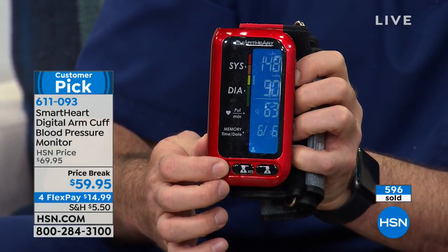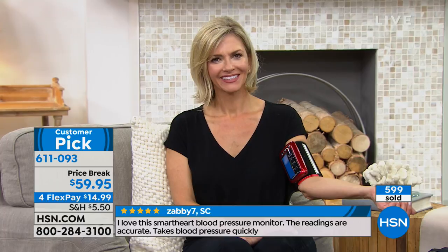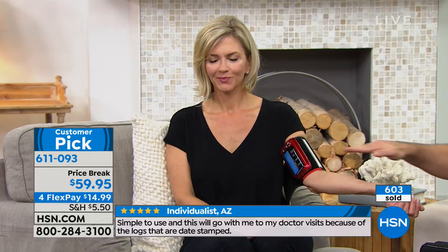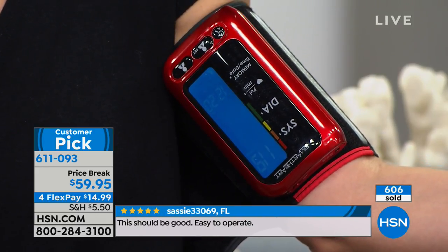Ideally, you want to be sitting nice and relaxed for about 10 minutes — hopefully not on live television, and not with coffee and stimulants. You want to make sure you're nice and relaxed to get that resting blood pressure. This does it all for you because where you put it on your arm is actually right at your heart level, which is exactly where you want it. That's where you're going to get the most accurate reading. It is clinically accurate and it measures that way.